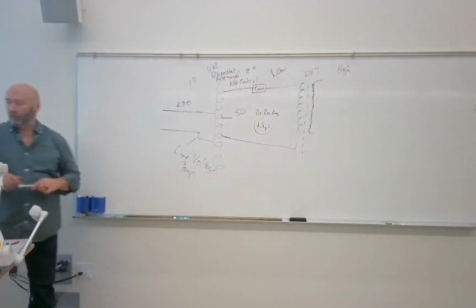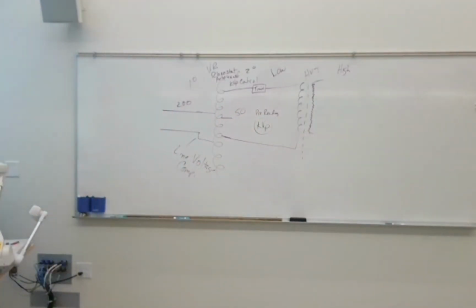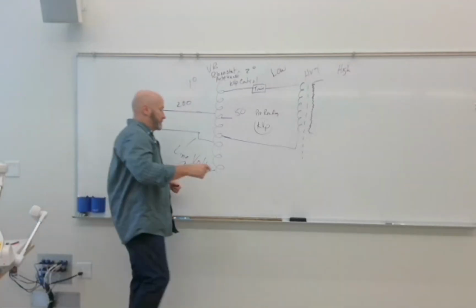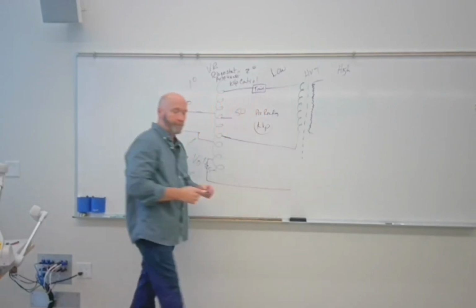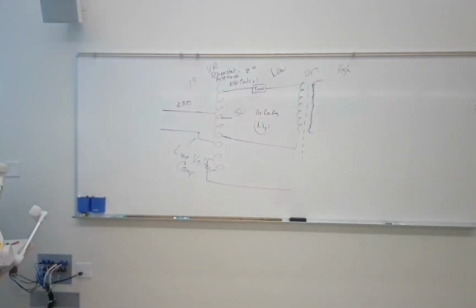But we also have to have a way to control our mA, right? Time we're going to get to in a minute. We have to control our mA, so we're going to have a separate circuit. And again, if you look back at the diagram on 111, you see that Bushong includes half of this circuit, the filament circuit, in the high voltage section. I'm going to call it its own separate circuit, just so as to not confuse it.